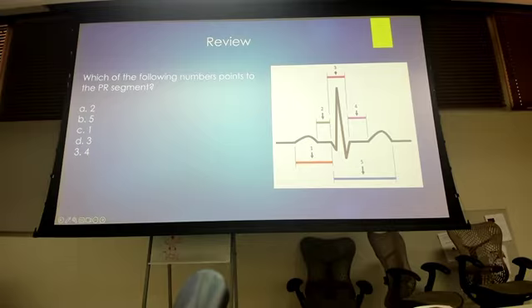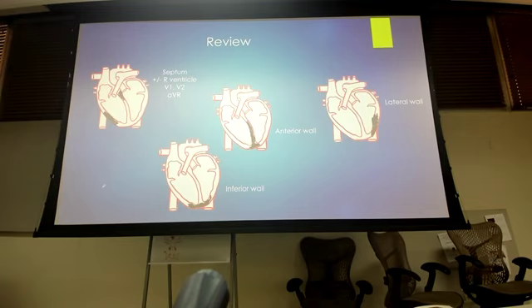V1, V2, so you gotta make sure we say V1 and V2 versus 1 and 2, because 1 and 2 are gonna be our bipolar leads. V1 and V2, and a little bit of that AVR, right? Nothing truly looks at the right ventricle, but AVR gives us the best shot that we have. We'll talk about that later and how we're really gonna look at that right ventricle in a retrospective fashion. Okay, so very good.